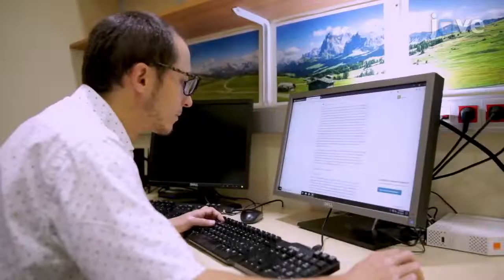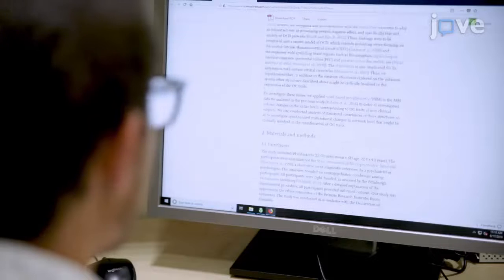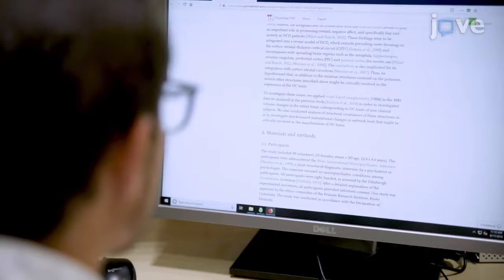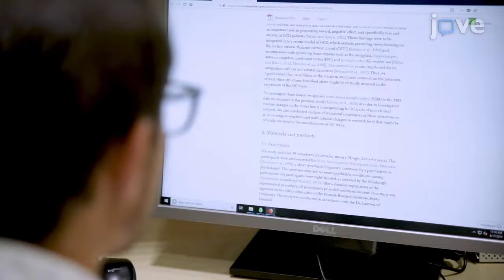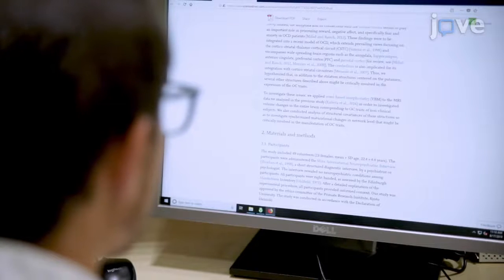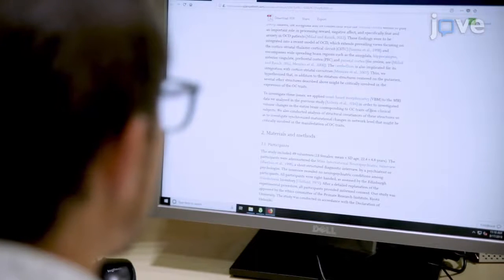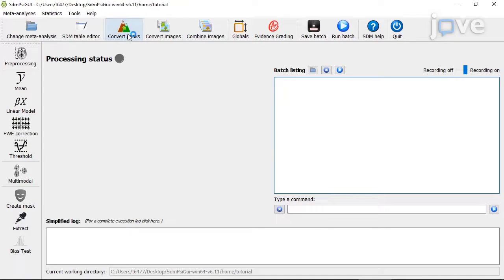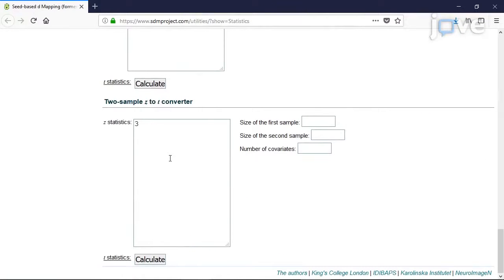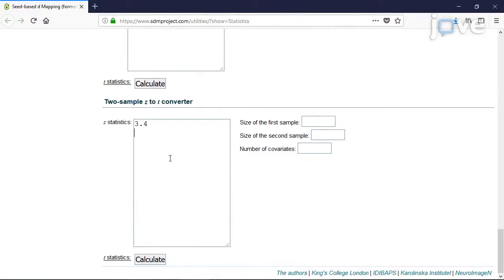After reading the manuscripts of interest to find the specific data to extract, to convert Z values and P values into T values, click 'Convert peaks' in the SDM PC software. Then use positive T values for peaks of increase and negative T values for peaks of decrease.